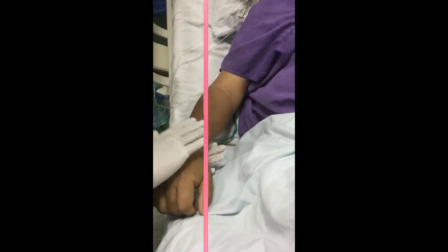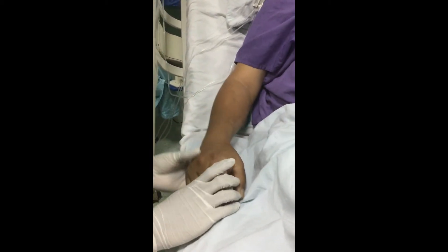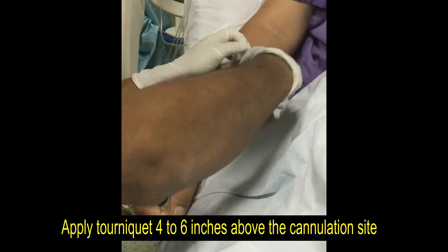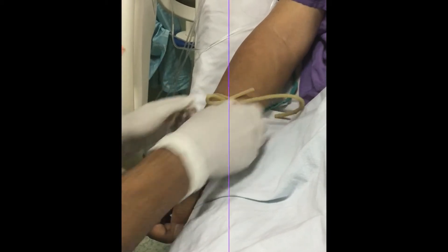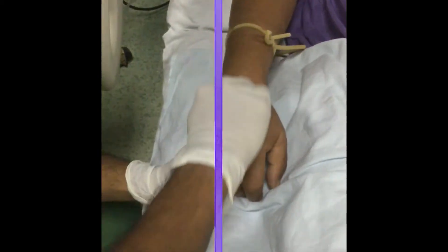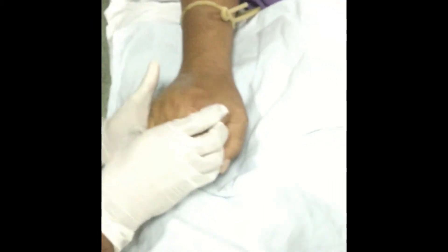Then choose a suitable vein and suitable site for IV cannulation. Use the distal vein of the hand and arm first. Apply a tourniquet 4-6 inches above the IV cannulation site, and then clean the site with alcohol or spirit.